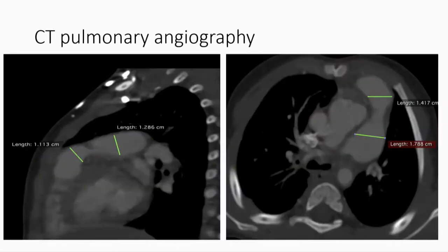Now the problem in this patient, can you show the coronary? The coronary arises from the RCA, courses anterior to the main pulmonary artery, and then dips behind the conduit and courses towards the left anterior descending groove. You can see in this picture the large conduit, which is proximal conduit is 14, distal conduit is 17, and the severely narrowed obstruction. And you can see the left anterior descending coming from the aortic root, coursing broadly in front of the pulmonary valve, and then dipping behind the conduit.